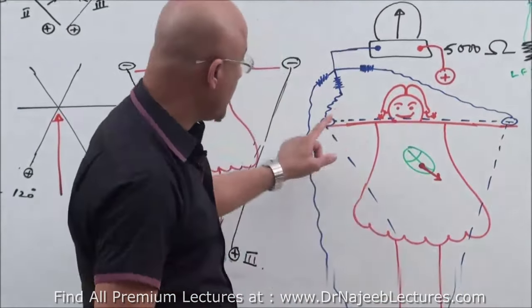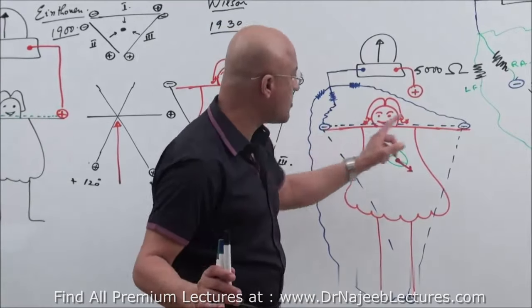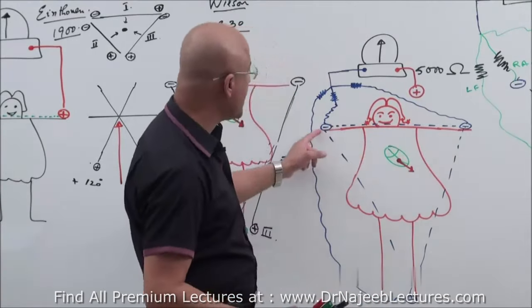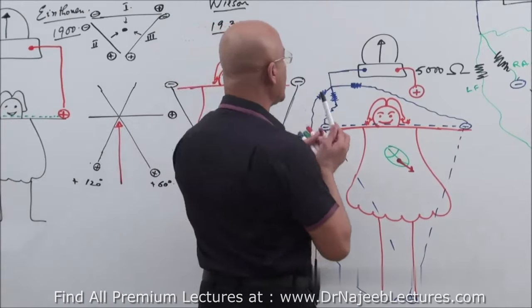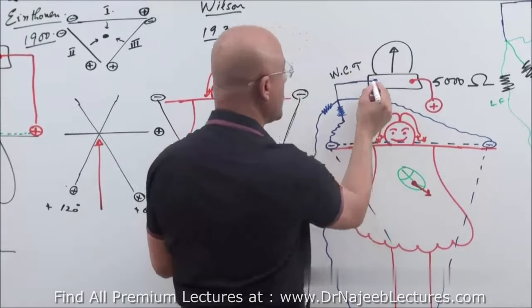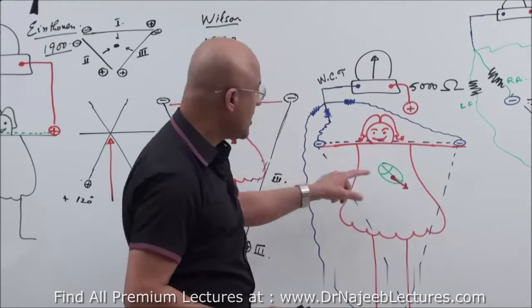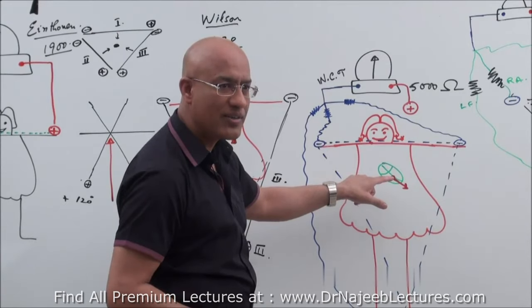Once the negative electrode, through the resistance, was connected to the right arm, left arm and the left leg, it converted into another type of triangle. For our purpose, we can call it the Wilson triangle. When the Wilson triangle is made and it is converted into a common terminal, this terminal is called the Wilson common terminal. Now he has achieved, in the center of the heart, zero potential.